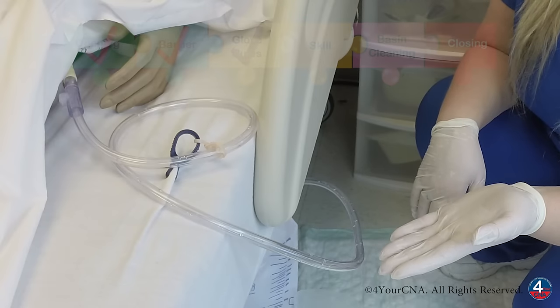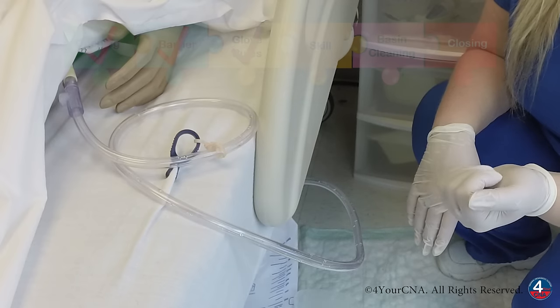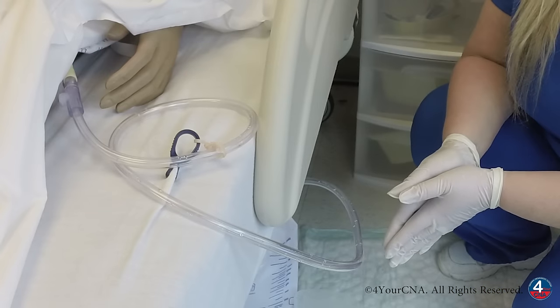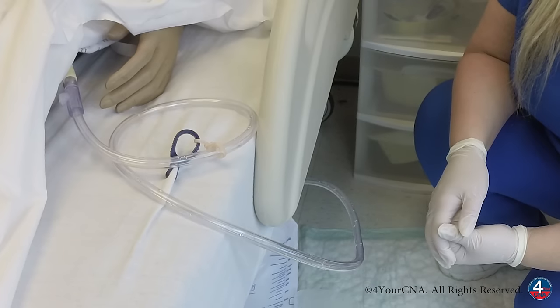I want to inspect the catheter tubing to make sure that it's coiled on the bed and the patient isn't lying on it and it's not kinked, but also that it's not hanging near the floor where somebody might get their feet tangled up in it and trip or accidentally rip the catheter out. This catheter looks like it's in the appropriate position.